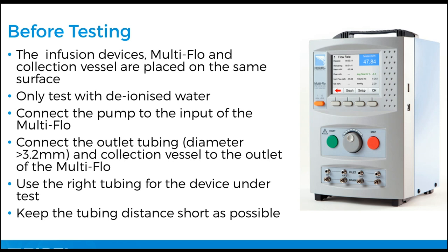Don't use saline. Don't use any tap water. Don't use any other solution than deionized, because we have a precision pump in there. And this precision pump is a medical pump and it will perform premium with deionized water. It's a bit like, if you want to keep your car well maintained, well serviced, and you want the performance of your car, you're going to use the correct oil. Very similar thing with the multi-flow. It requires deionized water to have longevity and performance of testing.